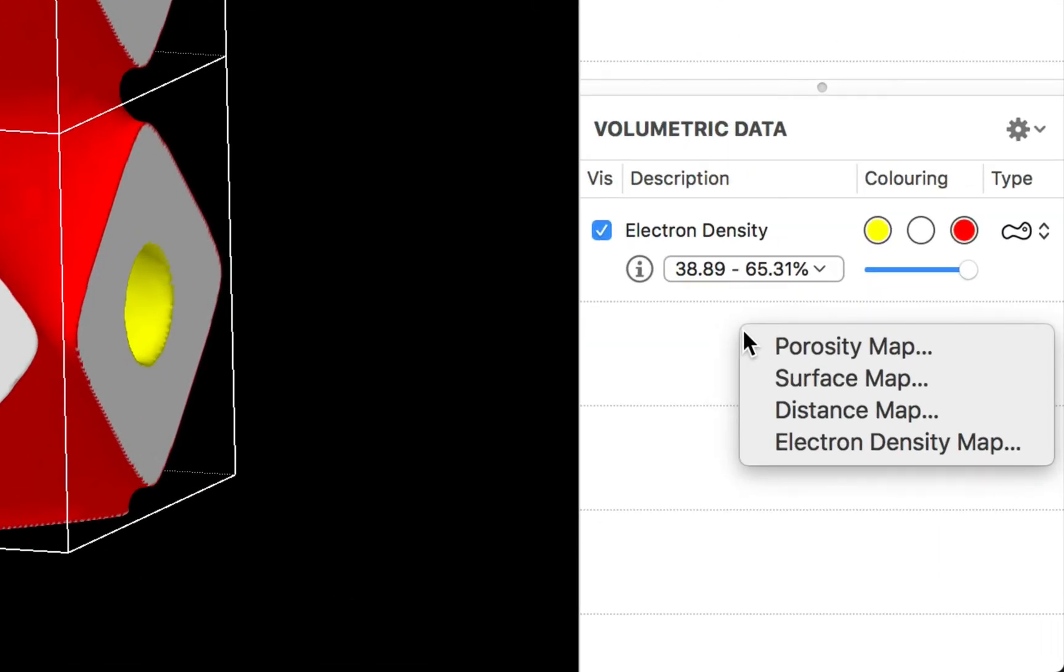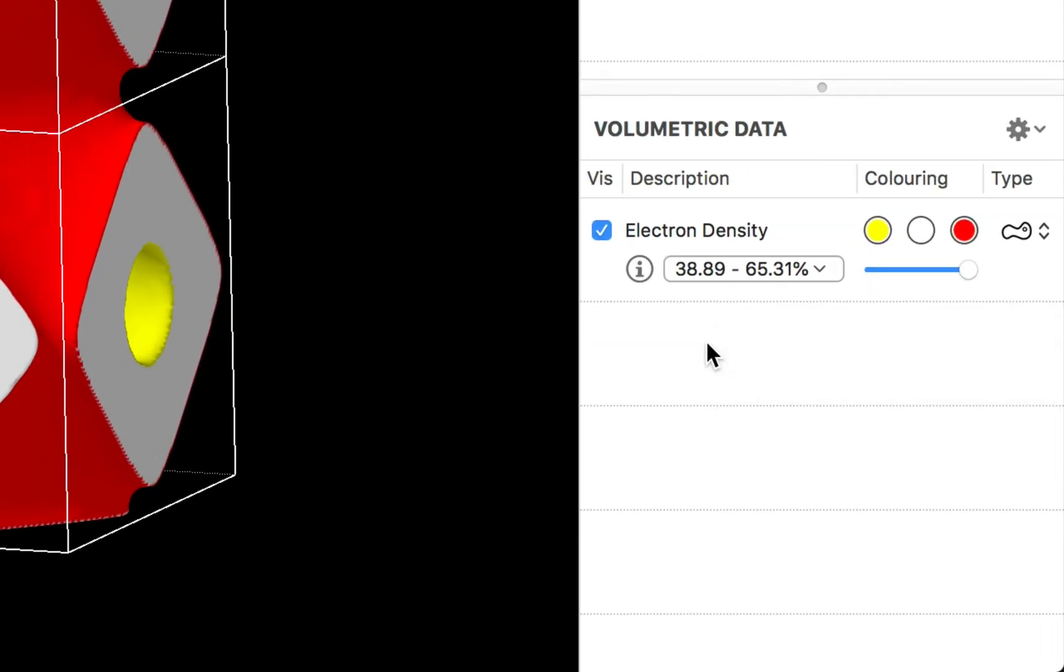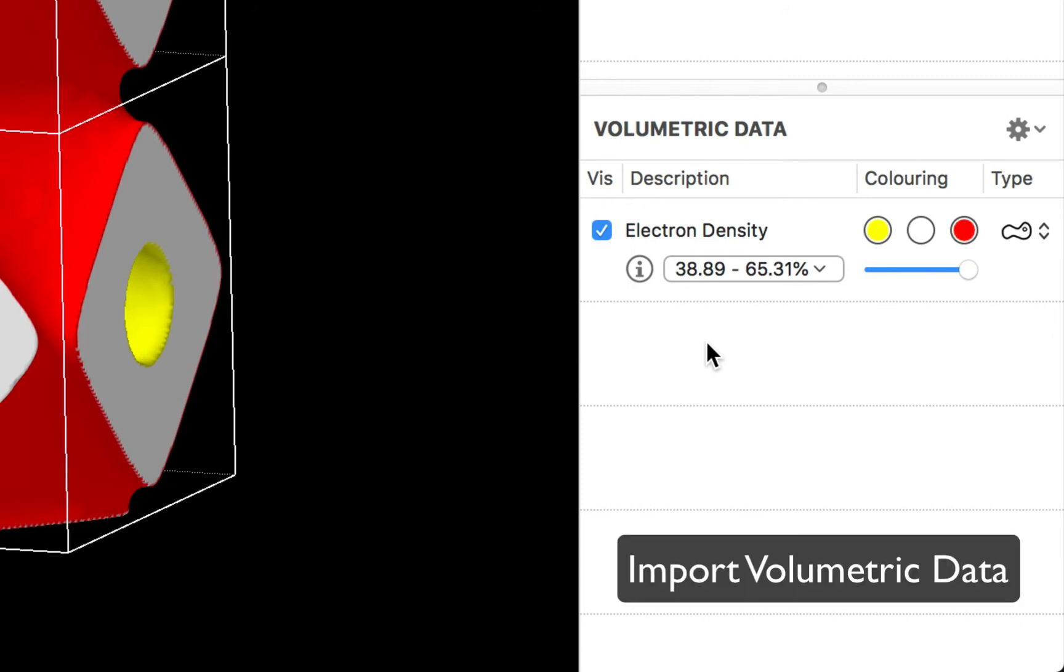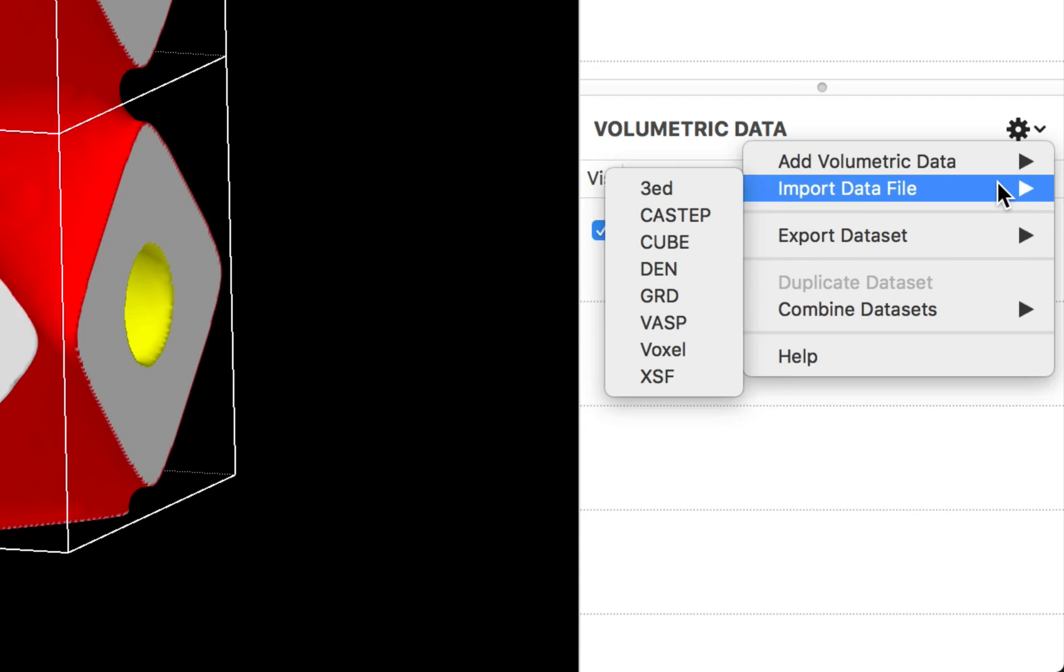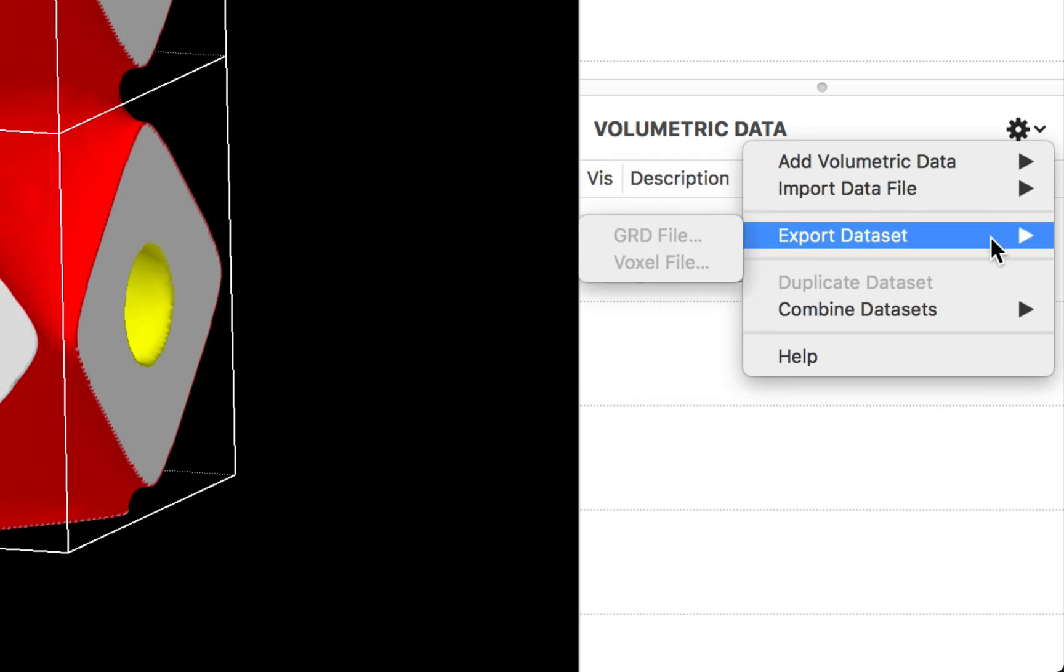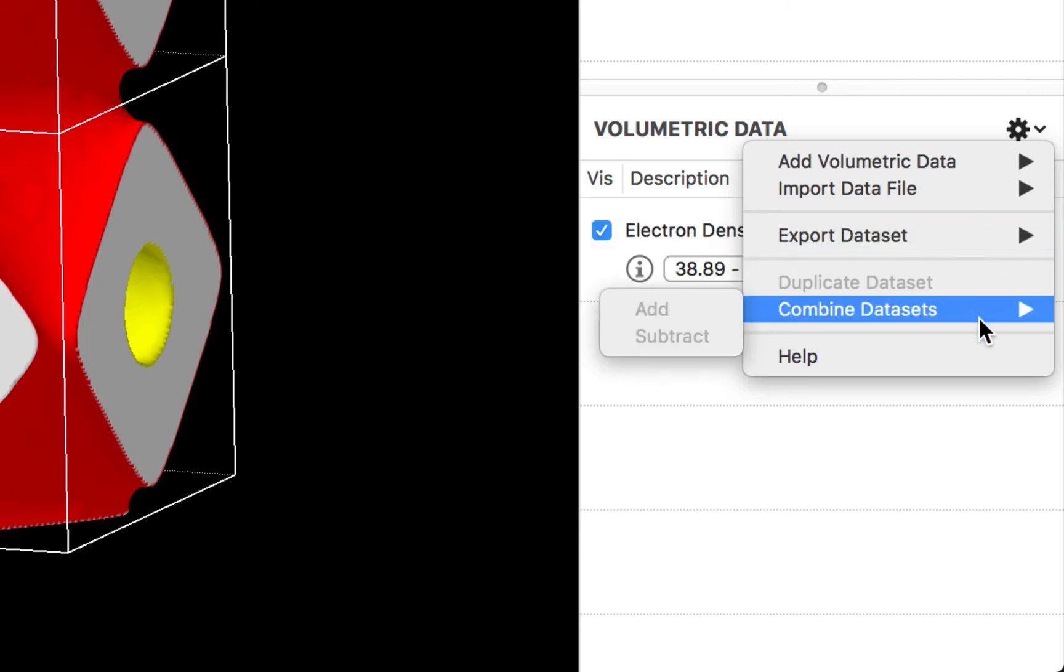So we can add porosity maps, surface maps, distance maps that CrystalMaker will calculate. But many of you will have your own volumetric data that you'll want to add. And you can drag and drop data files directly into this volumetric data group. Or you can use the actions button up here to import volumetric data from a wide range of formats that CrystalMaker supports. And you can also export data to different formats if you need to.